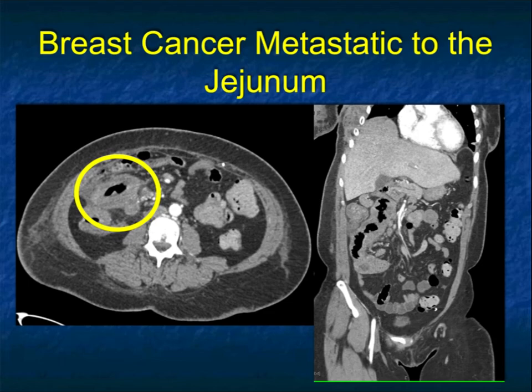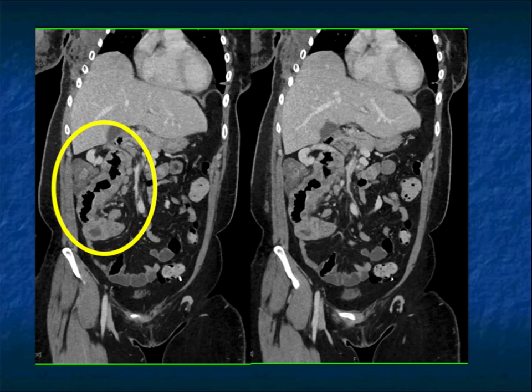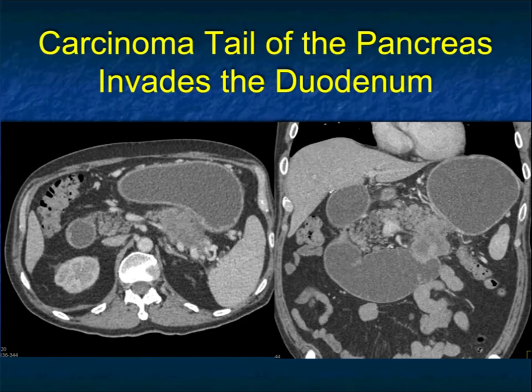Breast cancer: we talk about breast involving the stomach as linitis plastica, but also the small bowel. This patient had nausea and vomiting. The thickening of the bowel looks like a primary adenocarcinoma — you see the length of the lesion on the coronal view, with ulceration. I would have said adenocarcinoma or maybe lymphoma. This was metastatic breast cancer. Breast cancer can go to the stomach, small bowel, ureters, bladder, and kidney — one of the challenges of metastatic breast cancer.